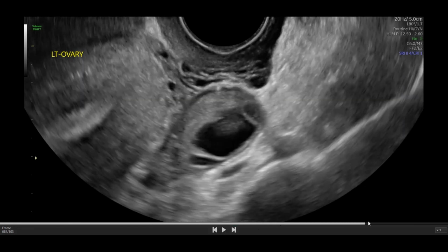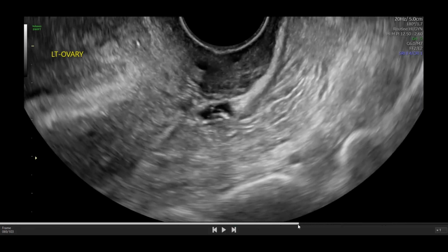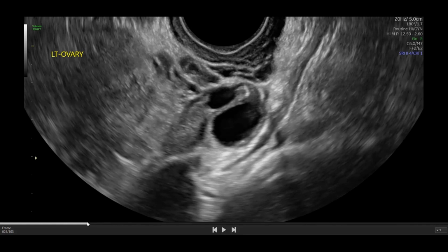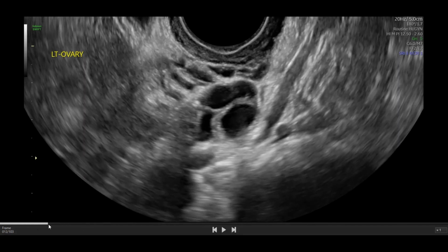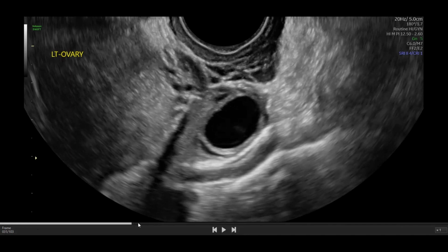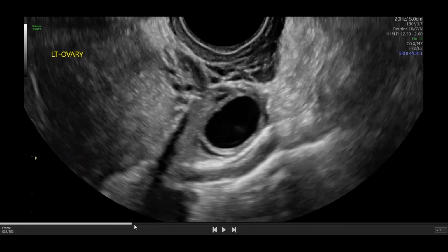And I'll be honest, at this point in time, I'm not sure what these are. I've talked to a few individuals who are experts in gynecologic ultrasound around the world, and they're also not sure what it is. My hypotheses, there's a few. One is endometriosis. Shouldn't come as a surprise if you know anything about me. I'm a bit endo-obsessed. And so endometriosis in a superficial endometriosis depiction actually does look like hyperechoic foci, but usually lining the peritoneum. So maybe that, but that's not really the story here at all.